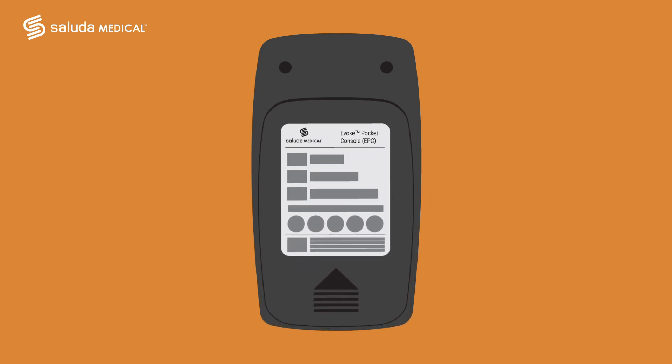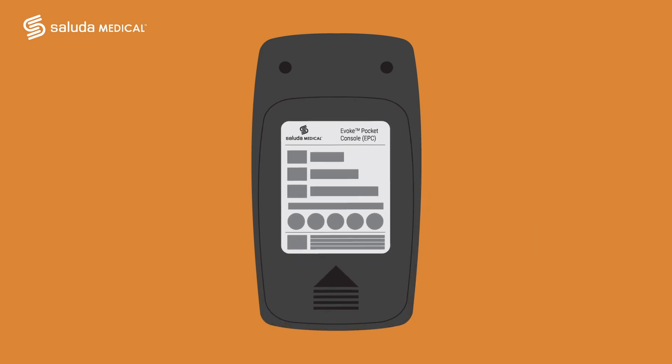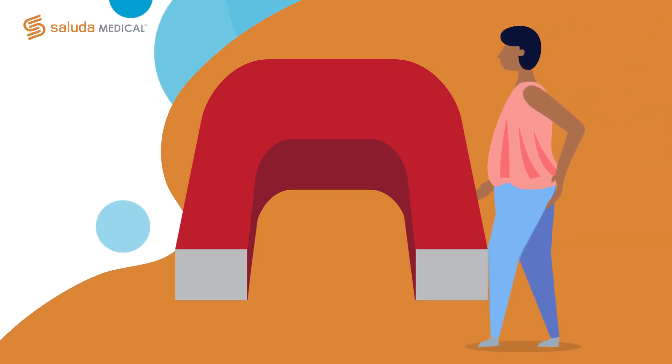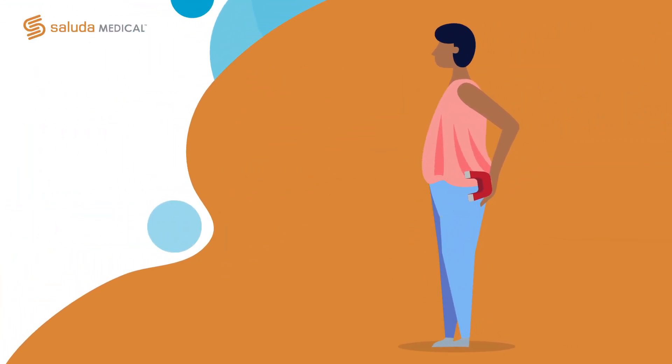Replace the back cover and make sure it clicks in place. Turn the remote back on to make sure that the low battery indicator is no longer lit. If you want to turn your stimulation off but cannot find your remote, you can use the magnet that you received in the same box as your remote.